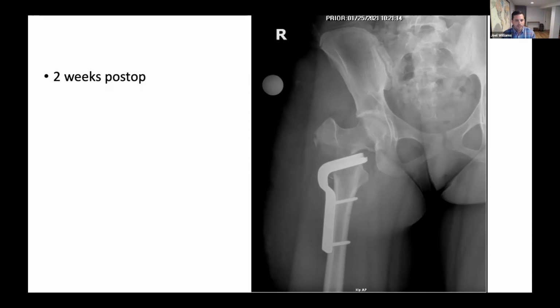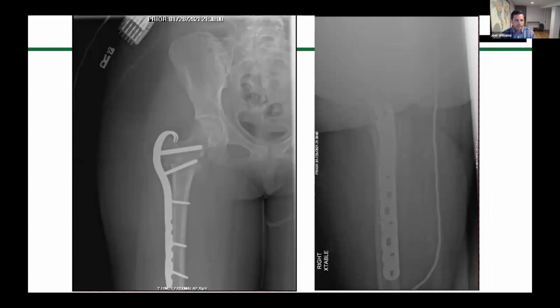I think the safe distance between the blade insertion site and the osteotomy location is 15 millimeters. I think if you have very young, healthy bone, you might be able to get away with a smaller distance. But if you're too close, or the bone integrity between the blade location and the osteotomy is insufficient, this can happen. So this procedure, to revise it with a proximal femoral locking plate, was done end of January, and she's doing well so far, but she's still healing at this point.